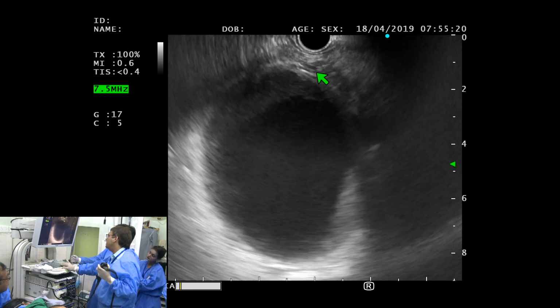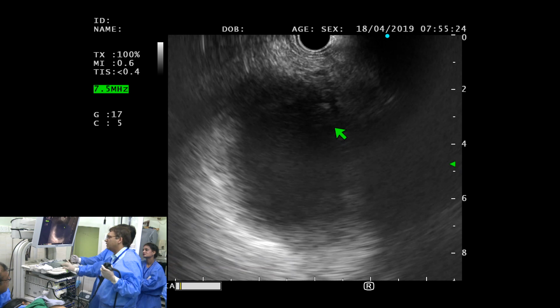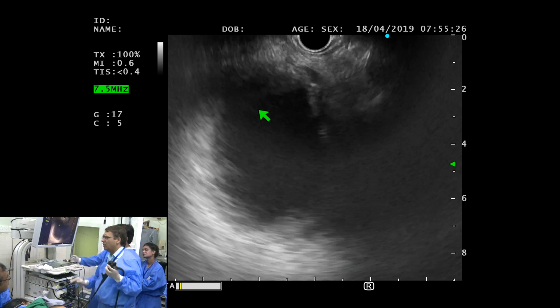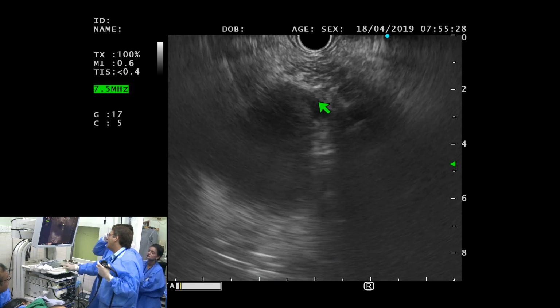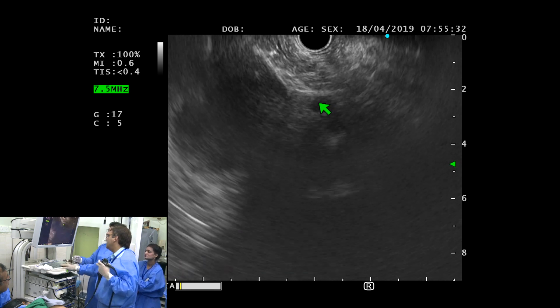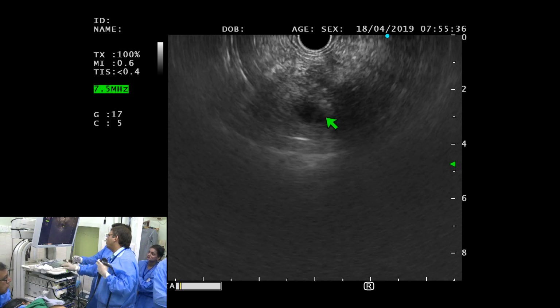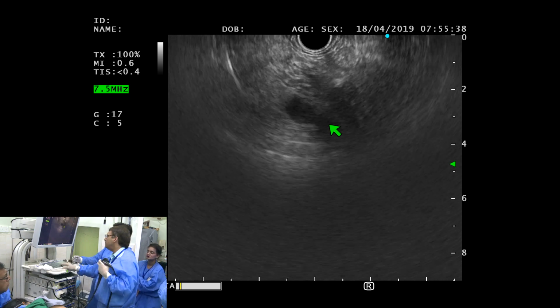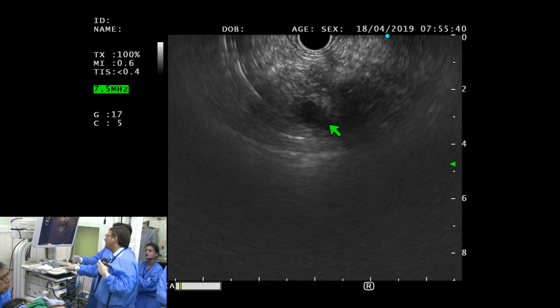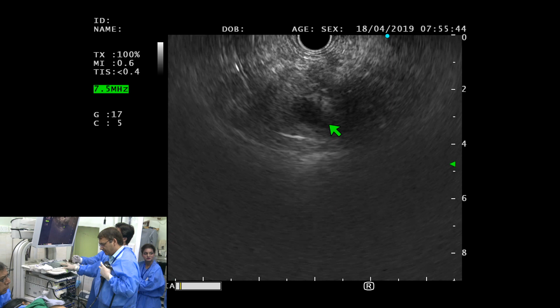It's all atrophied, with the features of chronic pancreatitis. This is going into the neck. This is all that cyst. I don't even see the portal confluence very well, even though I think it's right in this area, but I really don't see very well. I think this is the confluence right here. So from the body of the stomach, you can see the tail and up to the neck of the pancreas, and you can also follow it.